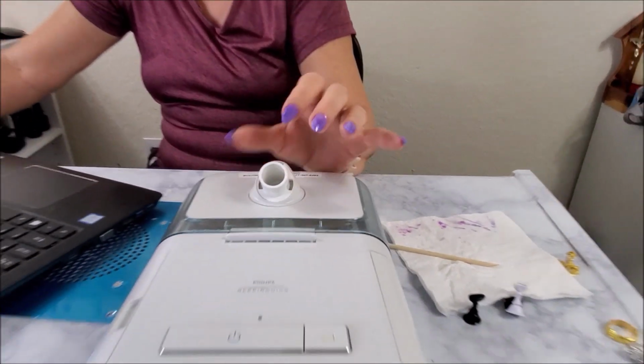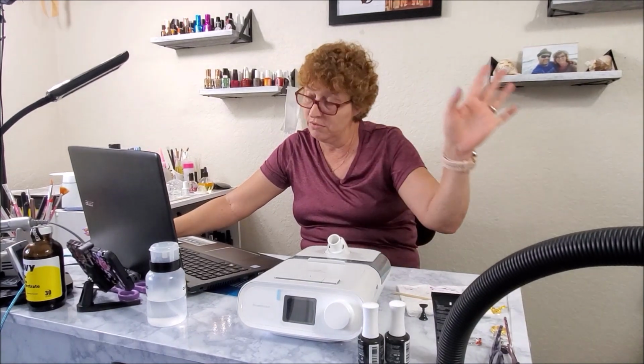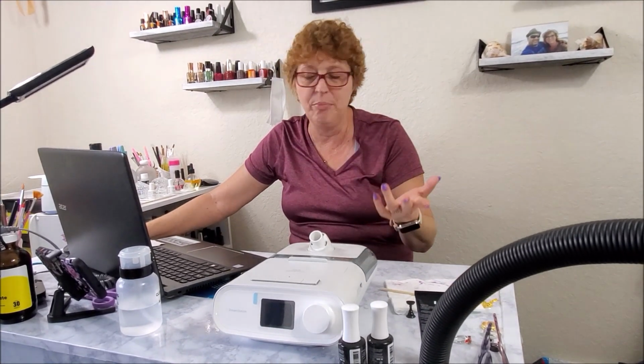Okay. Phillips has received complaints regarding the presence of black debris particles within the air path circuit. That would be this, your hose. Okay. Extending from the device unit, including the humidifier, tubing, and the mask, which I have seen every once in a while, and I just figured it was me slobbering on myself. Additionally, Phillips has received several reports of headaches, upper airway irritation, cough, chest pressure, and sinus infections. Now, I have been suffering with headaches. Anyway, upper airway passage irritations, which I have been, coughing, and pressure in my chest, right in there.